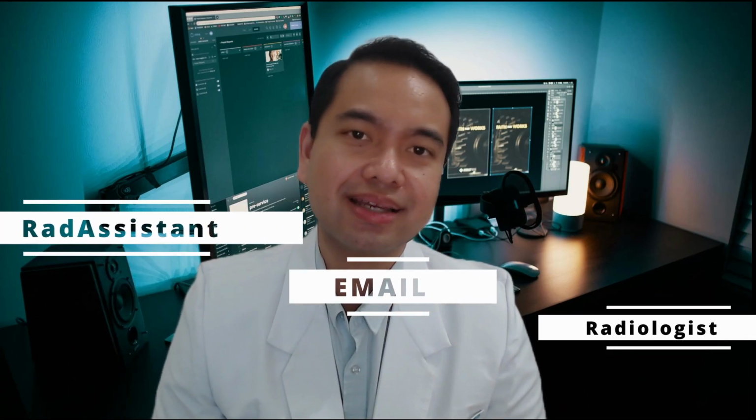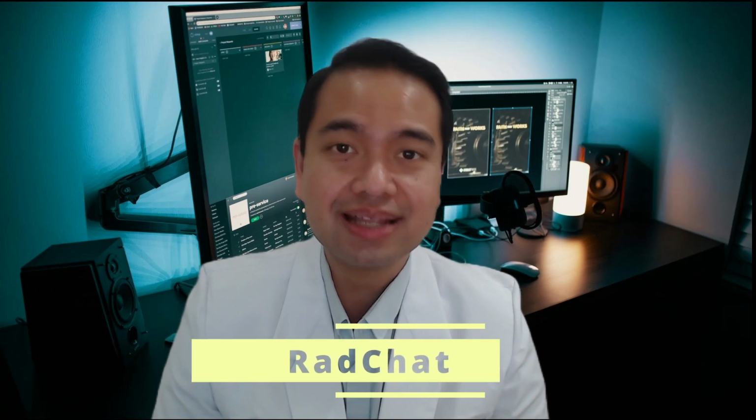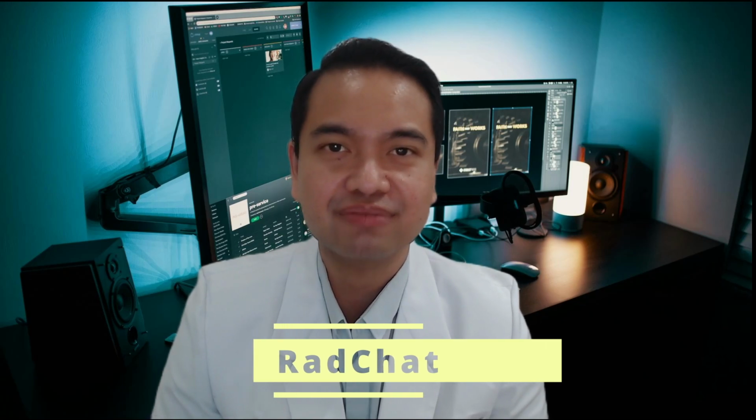But what would a radiologist want to build? What would I want to build for myself? What agentic team would I even want or need? What about an AI radiology assistant? One that can preview images that my co-doctors or co-workers have questions about. And based on their interactions, the RAD assistant can email me accordingly to escalate either an emergency or even draft a preliminary report. So all I have to do is double check it. And so this is the inspiration for the RAD ADK assistant chatbot with Google Gemini.